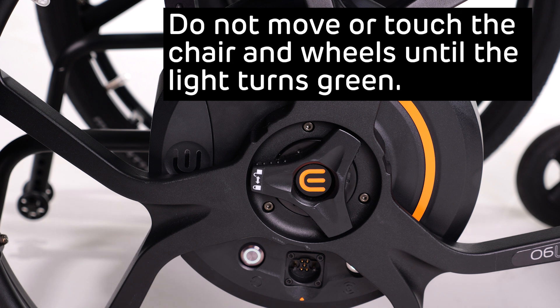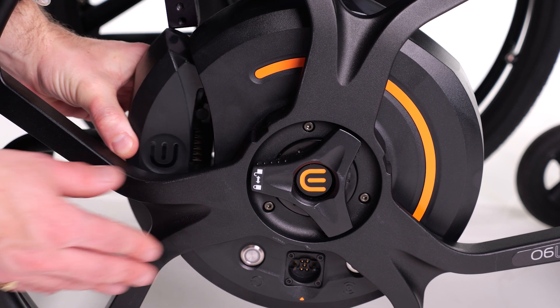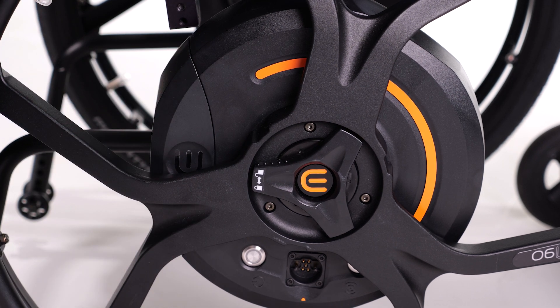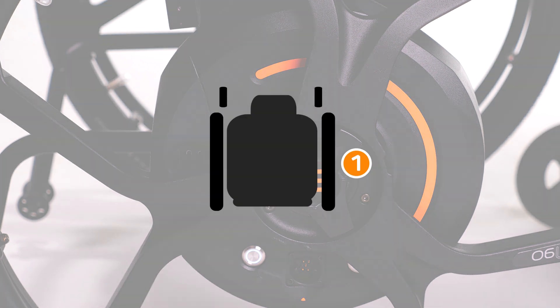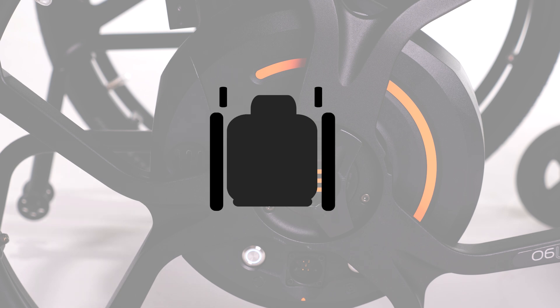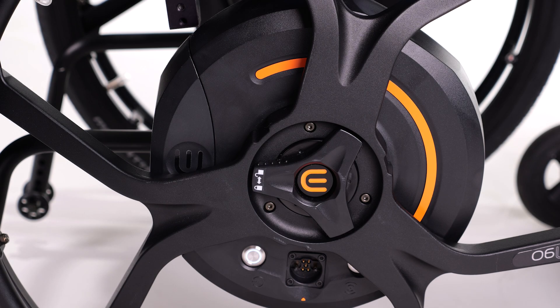Wait for the light to turn white and then turn green. Once the LED lights turn green on the wheel, remove the battery and reinsert it. The M90 wheel will then beep. This process needs to be repeated on the other side of the chair, as well as removing both wheels, swapping them, and repeating the process — meaning the calibration will be completed four times, twice for each wheel.